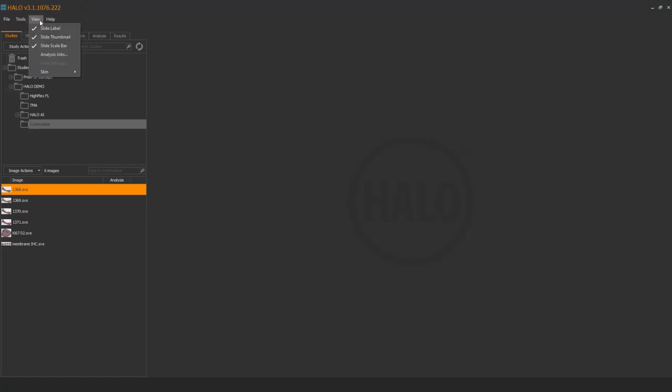Okay, and last but definitely not least, you've got the Help tab. So back when I started in Indica, there was nothing here at all. The application scientists would have to email PDFs to everybody in order to give them a very rudimentary guide in how you would use the software. So that's all changed, and it's always been upgraded and improved.